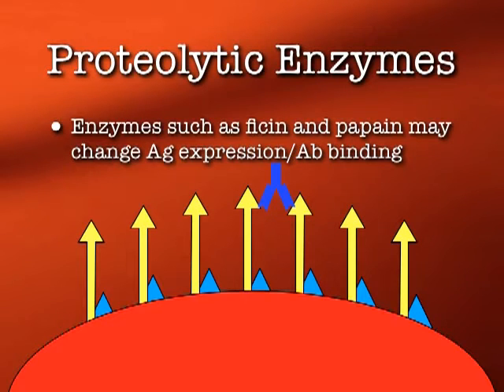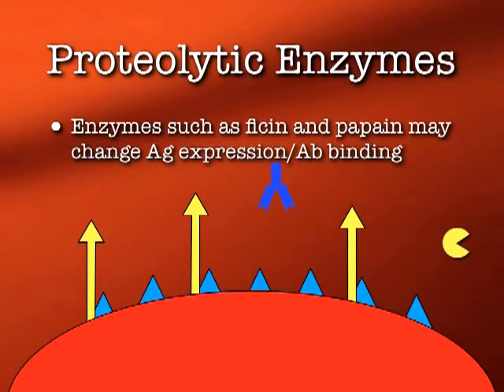Now, you and I both know that's not usually a big deal because Rh antigens are expressed well enough and the antibodies bind them really well. But if you throw in a proteolytic enzyme, it does its work, and you get loss of some of those glycophorins, well, guess what happens then? The antibody is able to move in and bind even better to those underlying antigens.